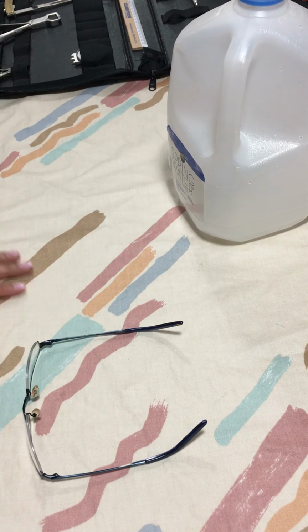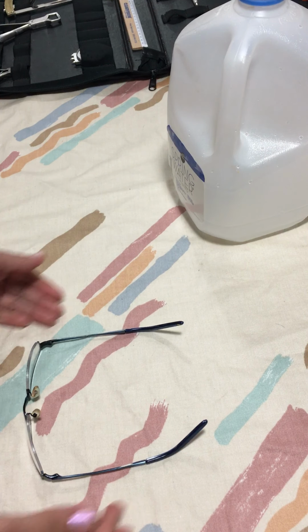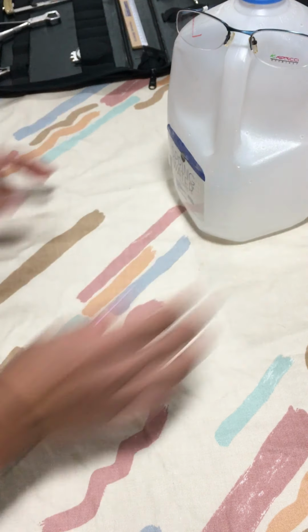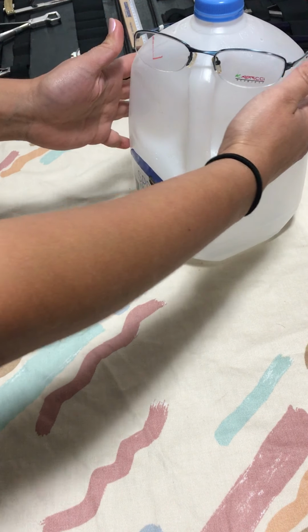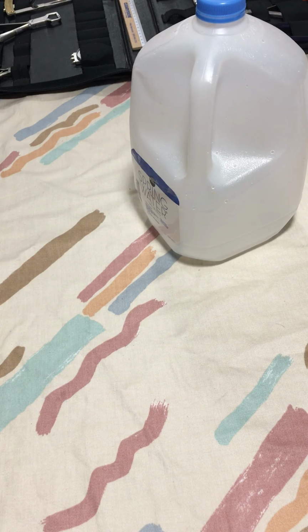Okay, it looks better. It's forming like a U form to it, and the temples look a lot more parallel. When I put it on the patient, I noticed that is much better. Now I'm not seeing that difference. I'm not seeing the difference. Okay. That was temple spread.